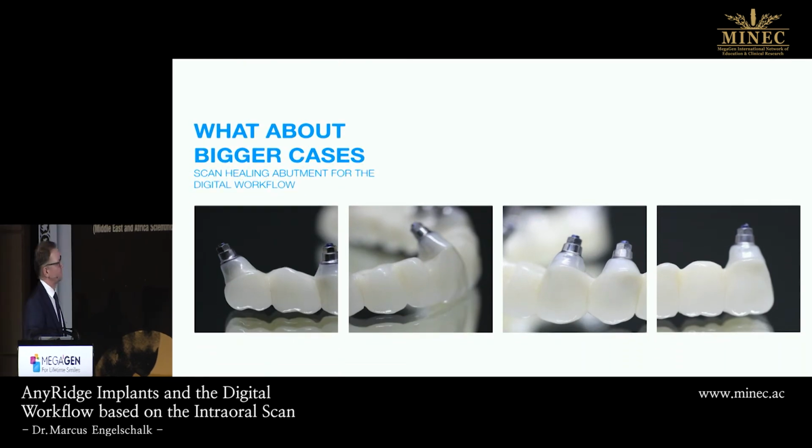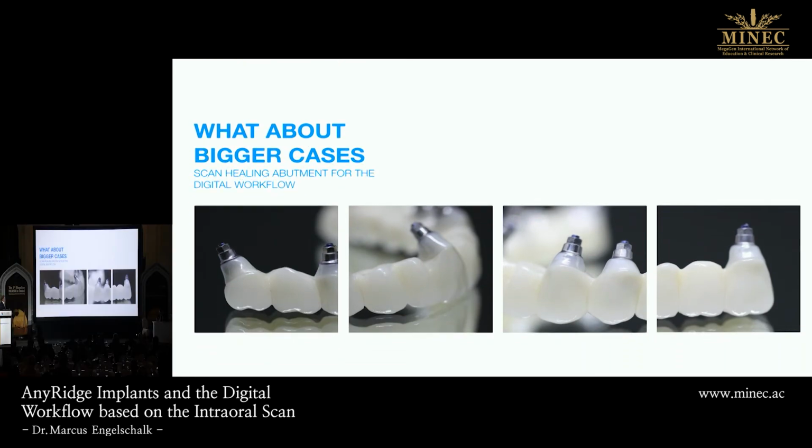You see here? This is beautiful. This is something which keeps the gingiva alive. The bacteria don't like this smooth surface. They don't like it. They like rough surfaces. But here you're creating very smooth surfaces. So peri-implantitis can occur, yeah, of course, but it's not so easy anymore. And it's easier to clean. So this is very important for you to know.